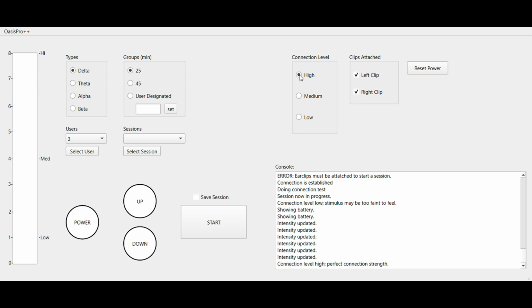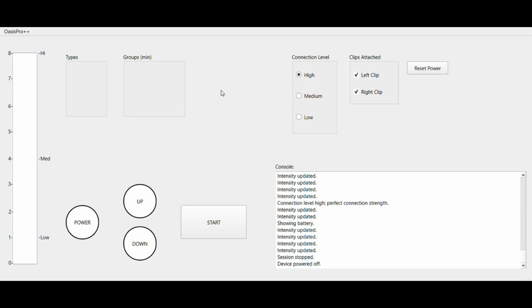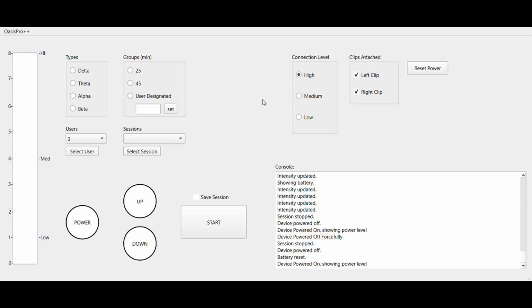But then if you fix that connection level, now it's high, so you have a perfect connection strength. Yep, and now if you hit power, you'll see the battery level still is there, but we can turn this off and we could reset the power, and now the battery's up, and you can do all the testing again.